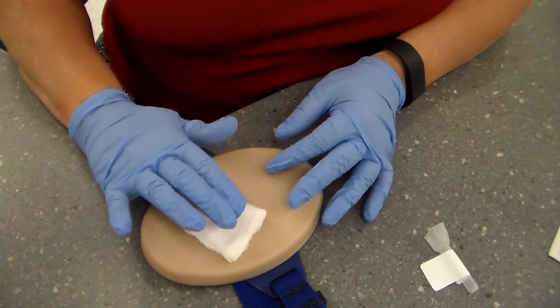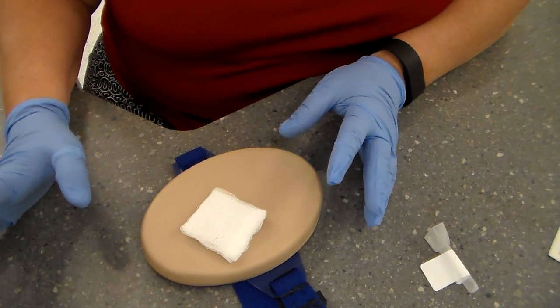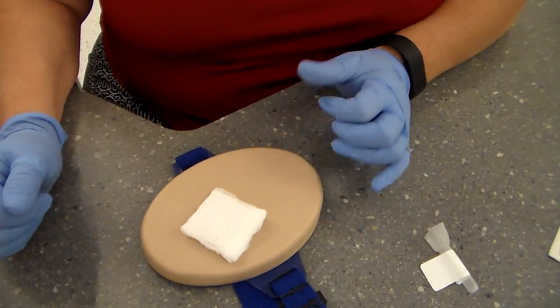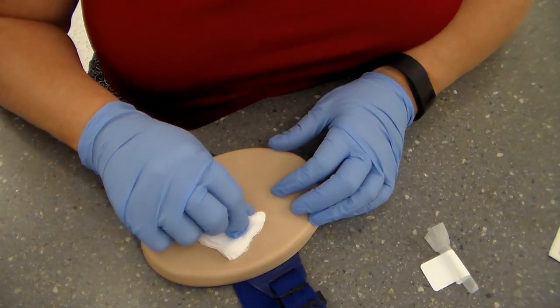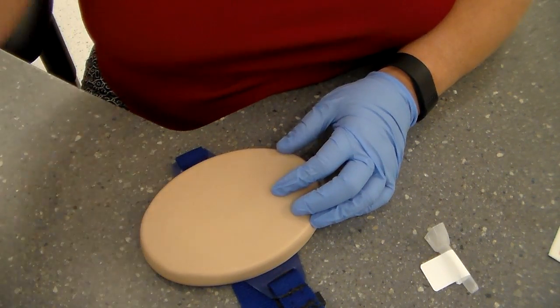So I've discarded it, and then I'm going to document the medication administration in my MAR. And I'm going to continually assess my patients on a regular basis, like we normally do, because we're nurses, right? So that is administering subcutaneous injections, skill 2.38.